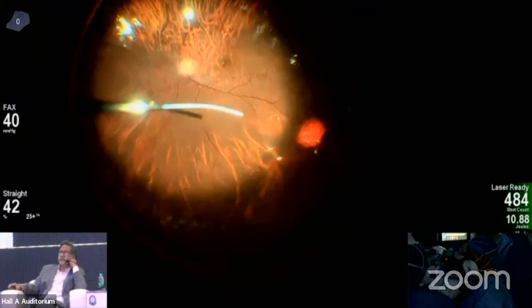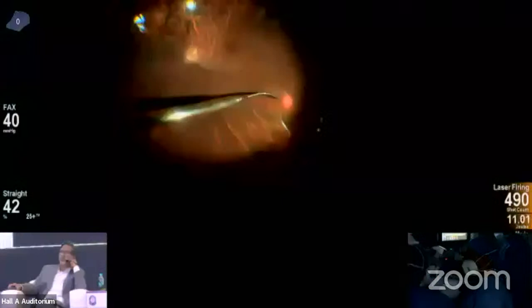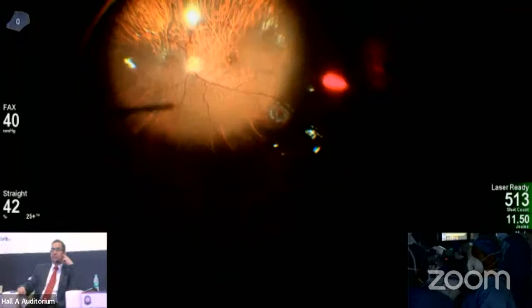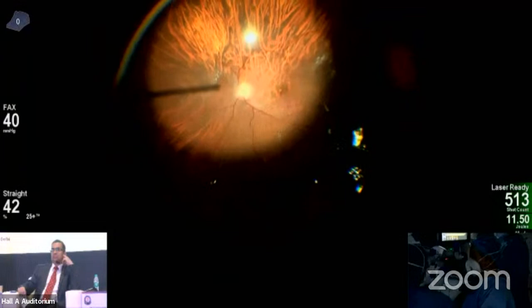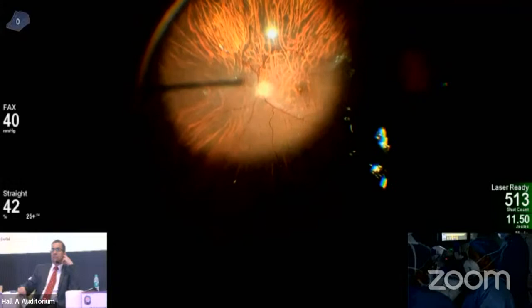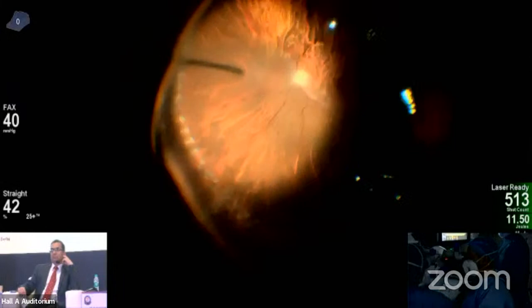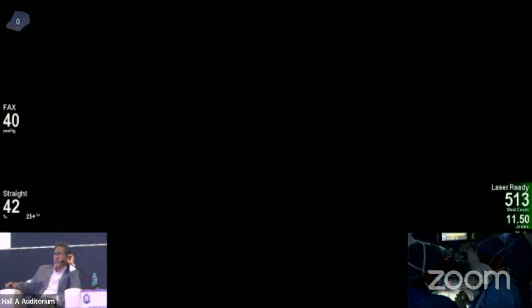Also, I noticed that the peripheral barrage laser which you have done is in a T kind of format, no? Yes, sir. So what is the reason for that? Sir, basically, just in case there is a small missed break, these radial extensions keep the fluid limited to one particular clock hour or 2 clock hours. If we do not do that, then the fluid extends almost 360 degrees. And we know that the more the fluid, the more the momentum, and the more the chances it will break through the laser. So doing these radial extensions prevents those things. This will prevent the retinal detachment progressing, and that is the thing.